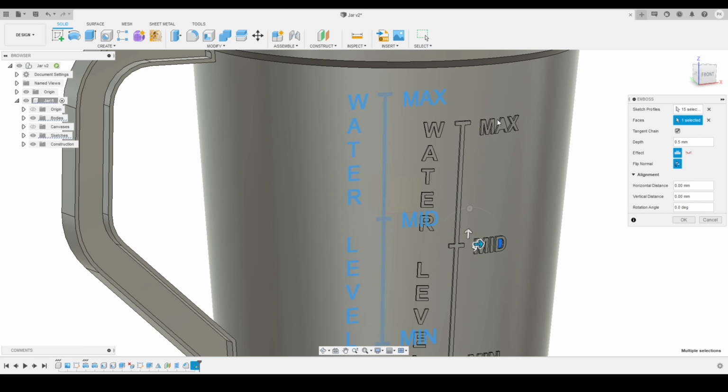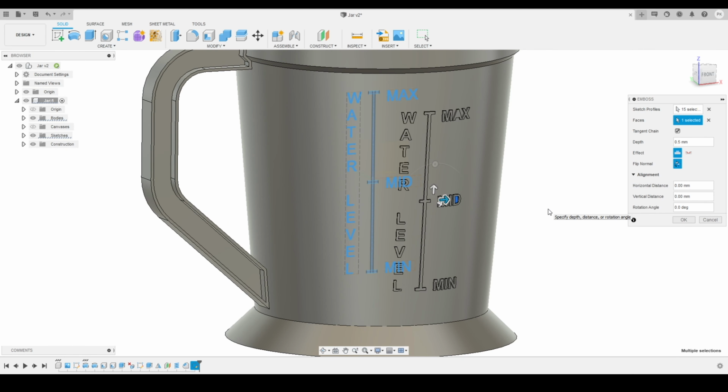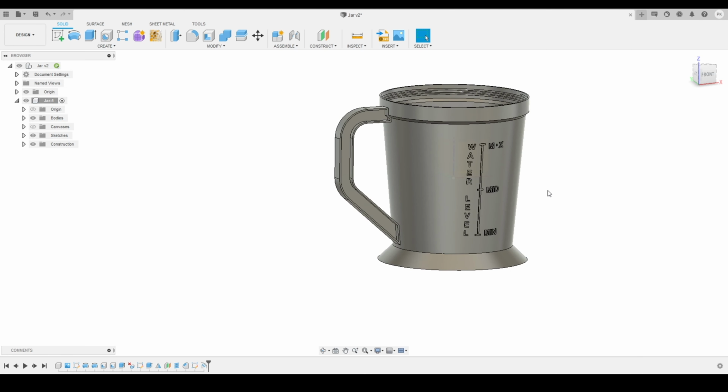Here you can see it's all good. The max is not coming out very good, it's because of the text font, so just forget about that. And if I press OK, so here is the result we got. Here you can see it will take a few seconds to process, and this is what we got.